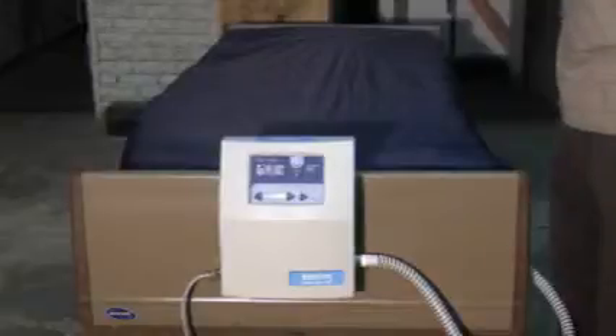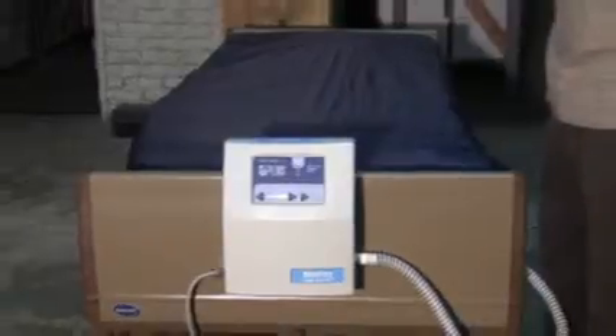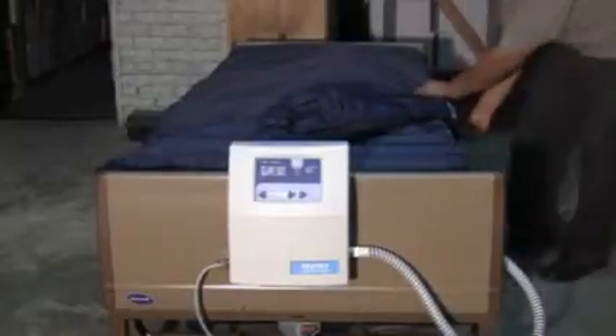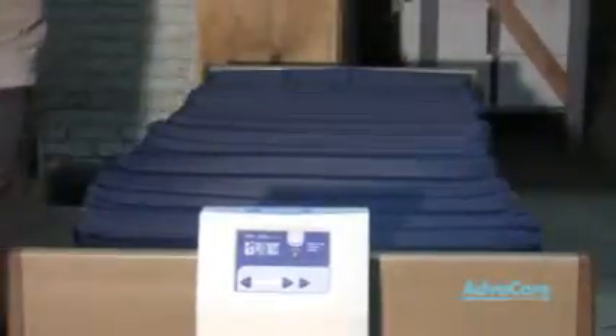The safety bolster top sheet may be applied by first removing the top sheet from your Plexus low air loss mattress replacement. Undo all of your straps from the locations on your mattress in order to remove your Plexus top sheet. Once all straps have been removed, you may remove your top sheet and set it to the side.